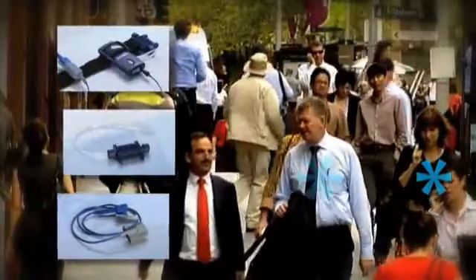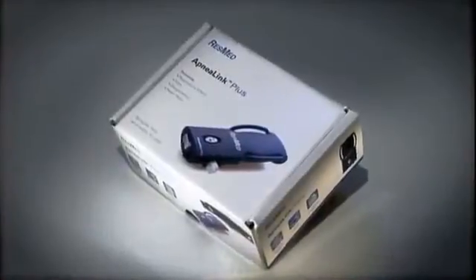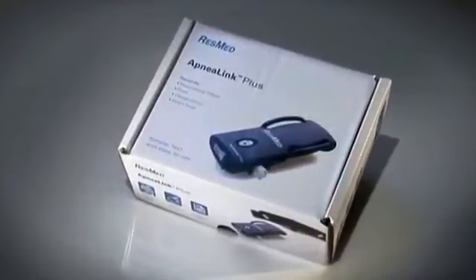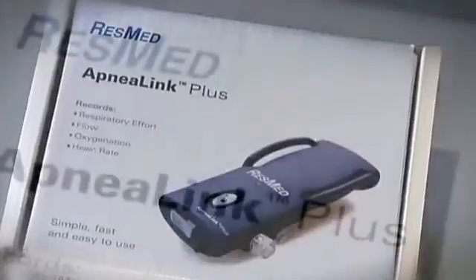A device that is unobtrusive and easy to use, yet records and stores a wealth of highly relevant diagnostic information. Introducing ResMed's ApneaLink Plus with EasySense technology — a Type 3 home sleep testing device, the latest addition to the ApneaLink range of diagnostic products and accessories.